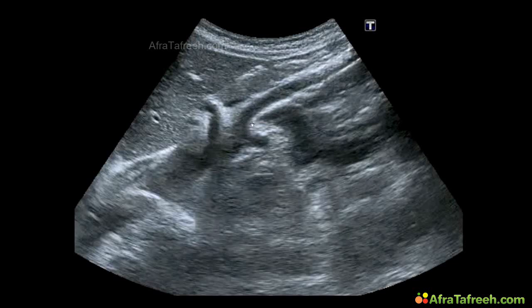And then we remember the SMA was quite close to the pancreas. So we can use this as a guiding structure. And the SMA was posterior to the pancreas in the transverse plane. So we have to look for the pancreas superior to this artery. And when the artery is over here, this area is the area where we expect the pancreas. You can also see this tiny structure over here. It's also echo-free. It's a vessel. Do you guess what this structure is? It's the splenic vein in cross-section.